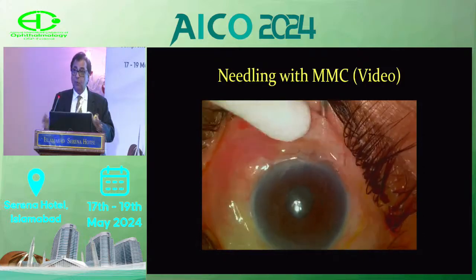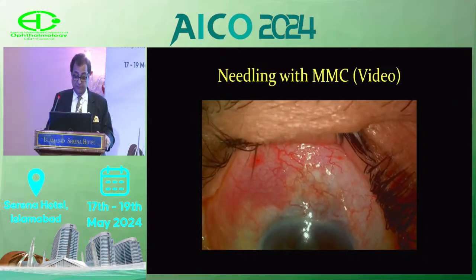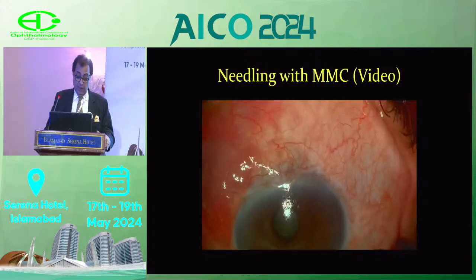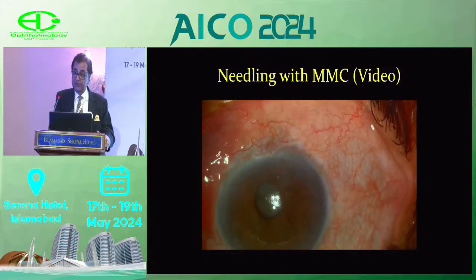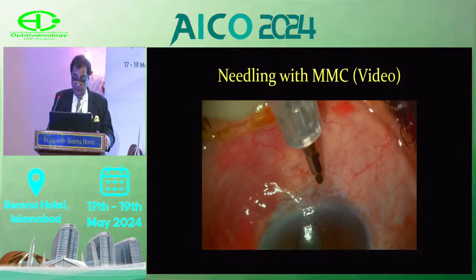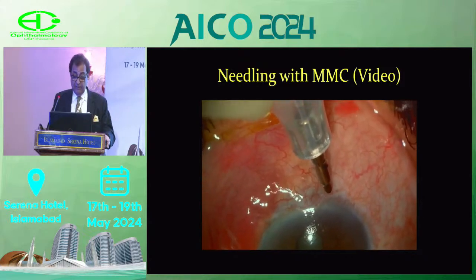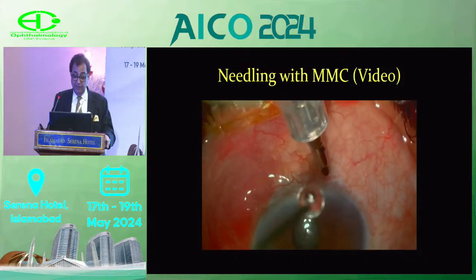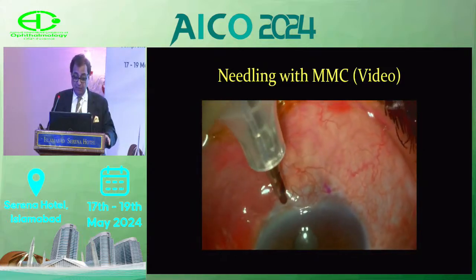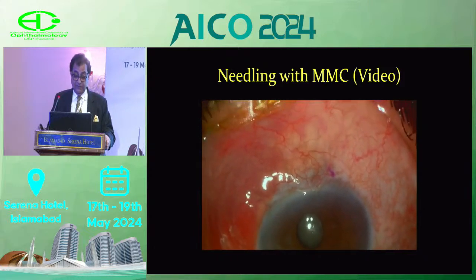We have done this video in 2 portions, and then we have put these 2 portions together. If you look at this, you can see the flat bleb, and I put a marker to make a slight outline for myself to make my life easy, because once you inject this drug, sometimes the conjunctiva balloons up and the marks are not visible. So that's where the surgery has been done.